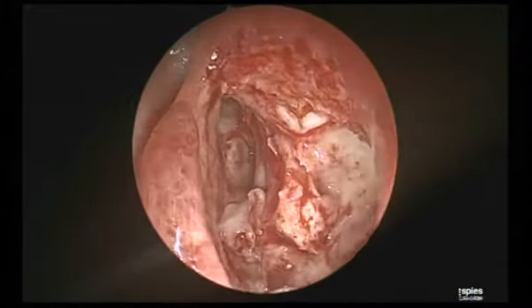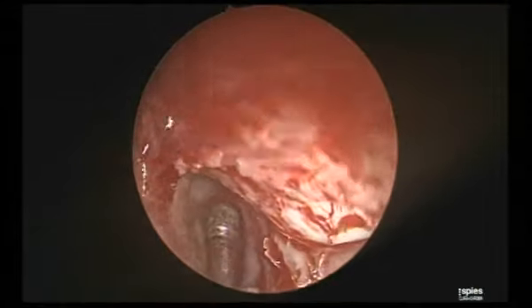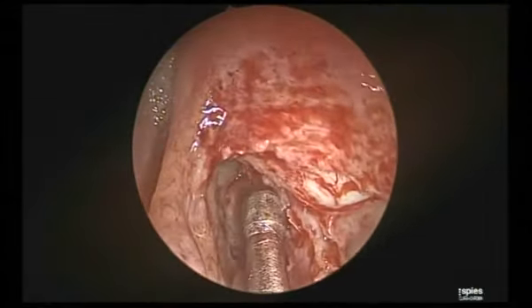See, what I have done is the irrigation. You have flushed, so that it takes away the blood stains and makes your field look better. Can you remove this?